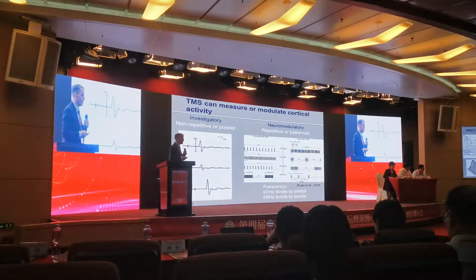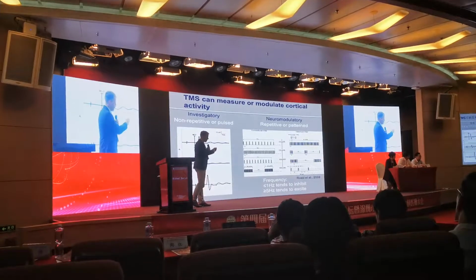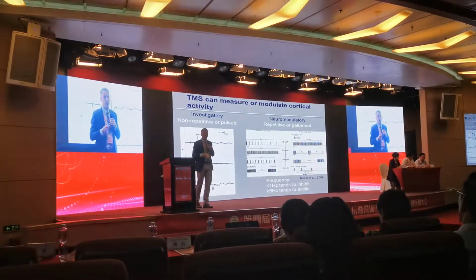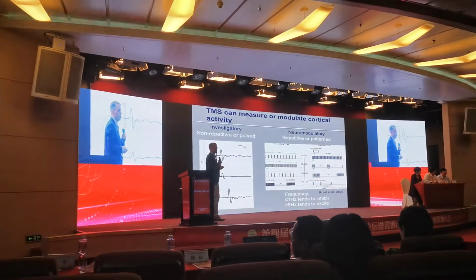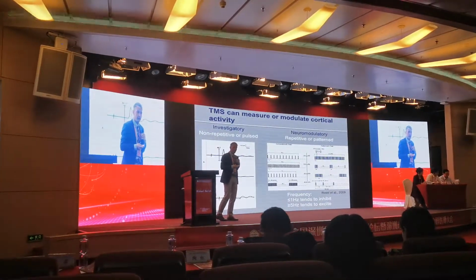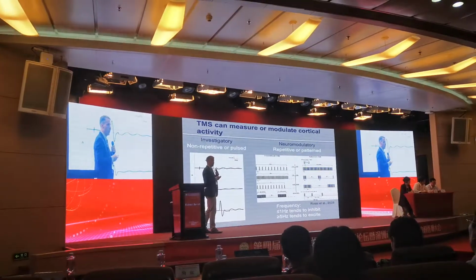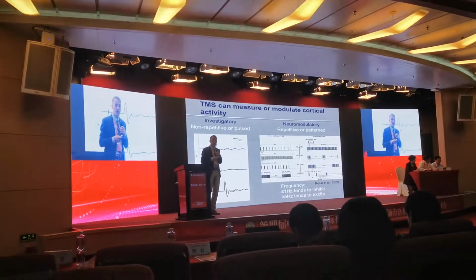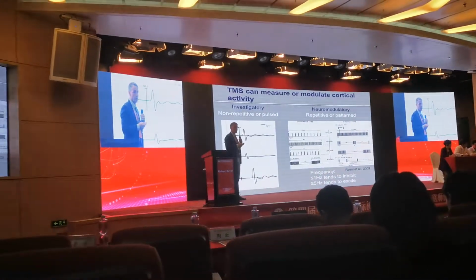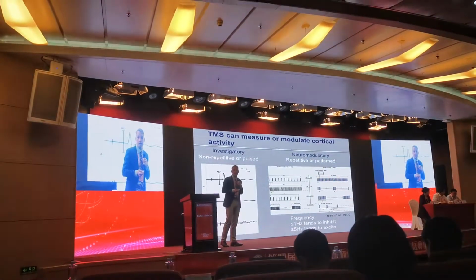Parameters to do so. And then, of course, as was talked about very nicely in the opening talk, we can also use TMS in a repetitive way, or a way to modulate cortical excitability. So you can either upregulate or downregulate excitability. And when we conceptualize that in our lab, we're thinking about a way, again, to change for a transient period of time the excitability in a region that we would like to target with our rehabilitation interventions. So we're using it in a way to prime the system for learning.